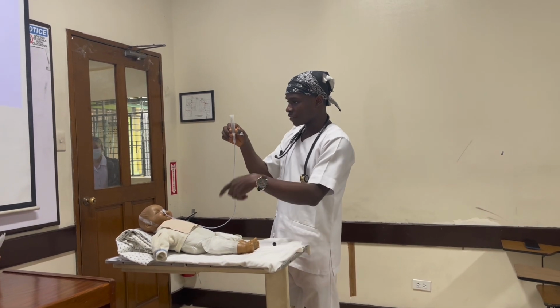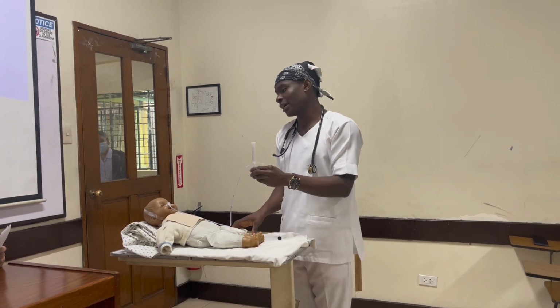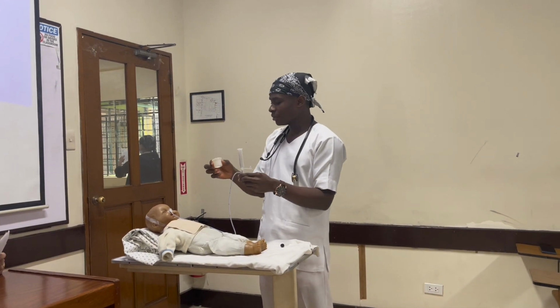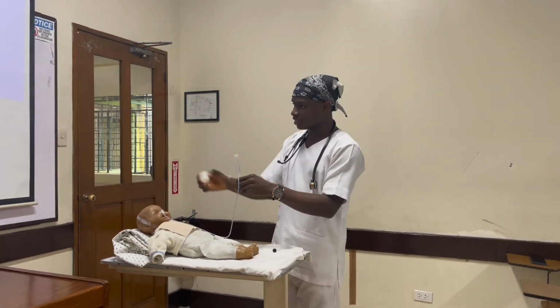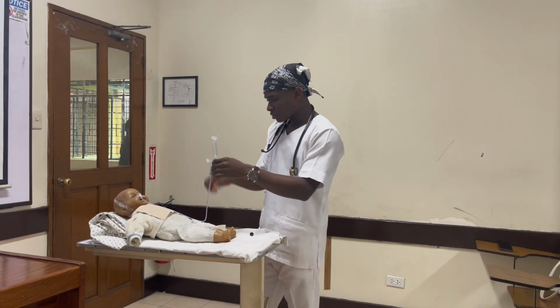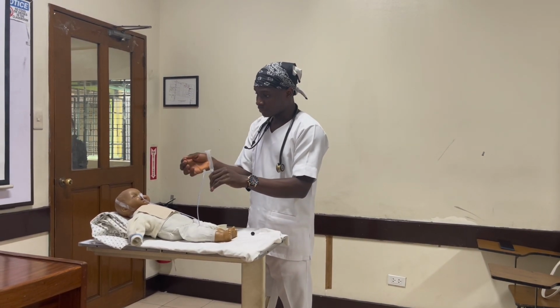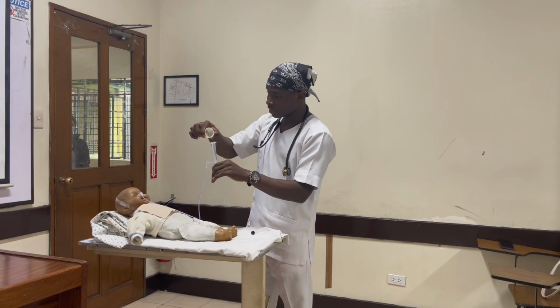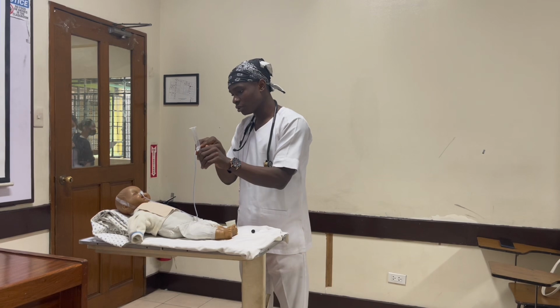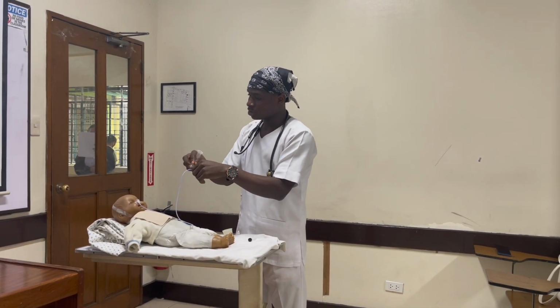Then as it's flowing, when it gets down to the 1 cc mark, you kink again. Then this is now time to add the milk. Maybe the doctor prescribed 30 cc. So if this is 10 cc, then this is already 30, so it is completely 30 cc. Afterwards, when the milk is almost about to finish, then I put the last 5 cc of water in order to flush. Then when it's almost done, I take out, then lock, then release.